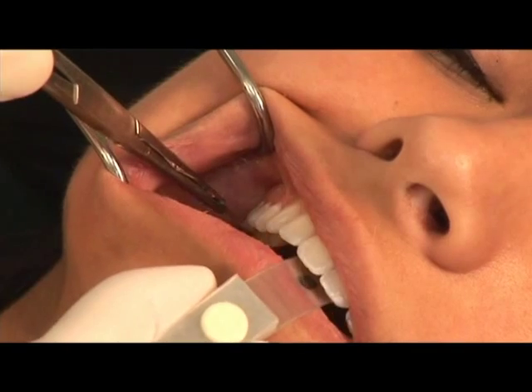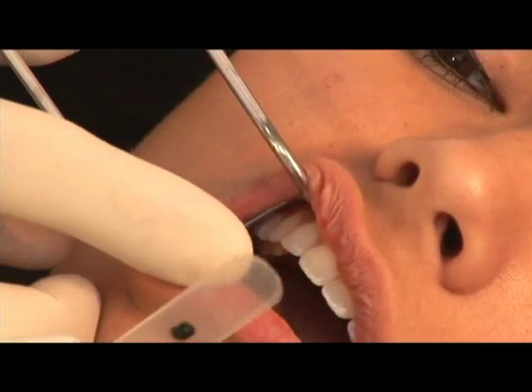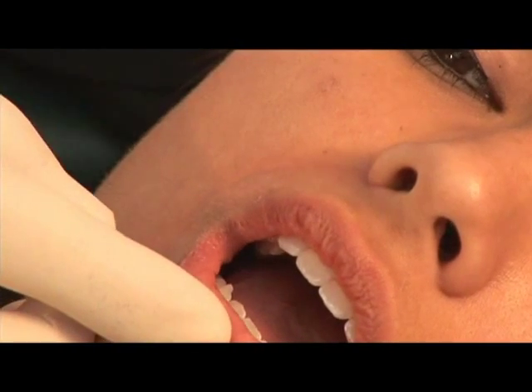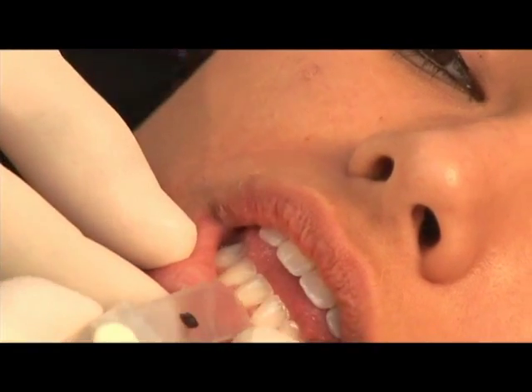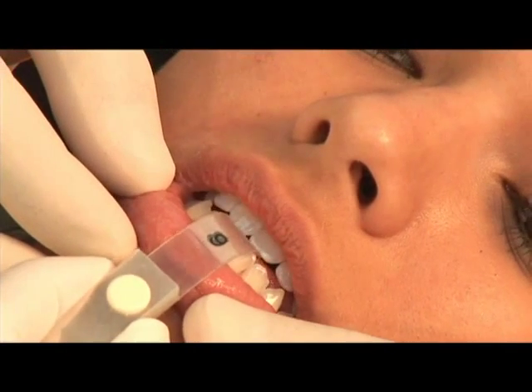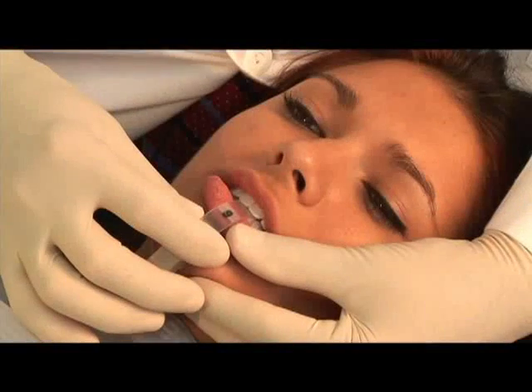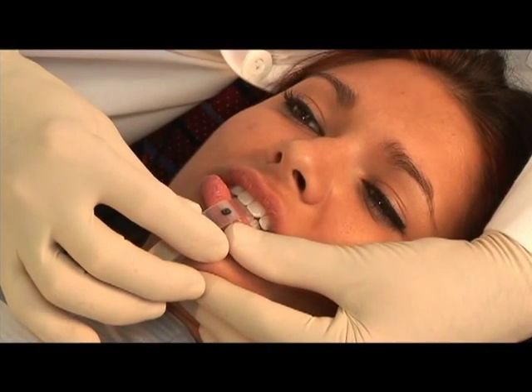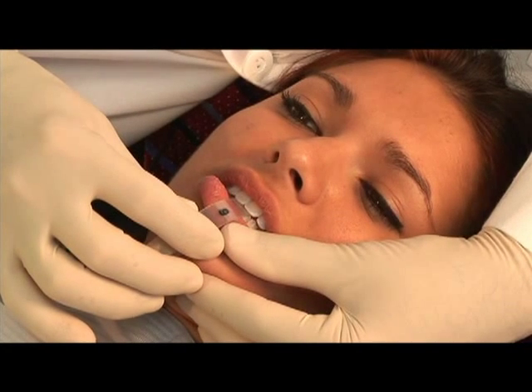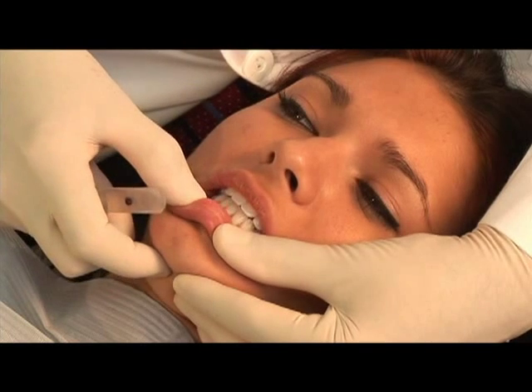Okay, open for me here. Take the cheek retractor out here. Go ahead and put the leaf gauge in for us, please. Close, slide forward and back. Okay, I'm going to have you just barely open. You should feel that tooth touch in just a second. Open slightly for me. Feel that tooth touching?